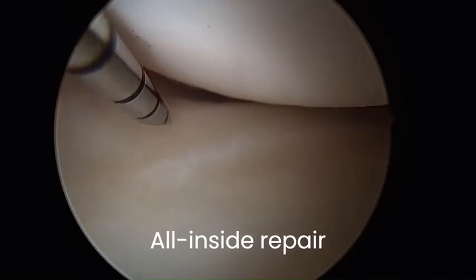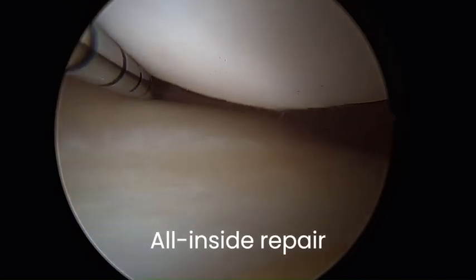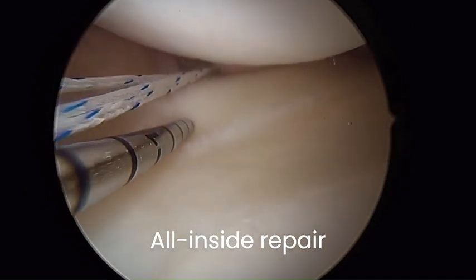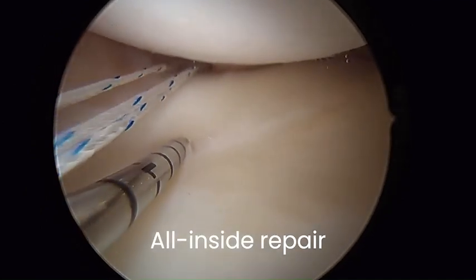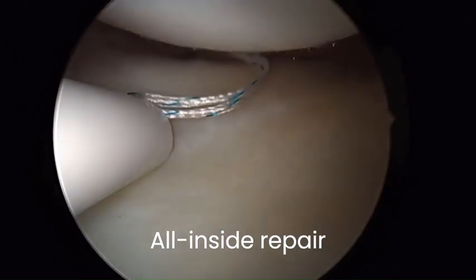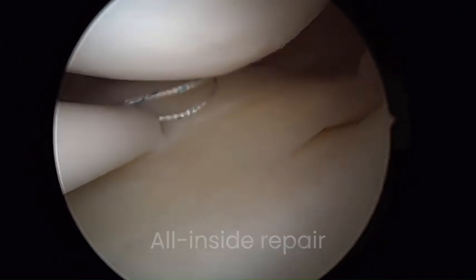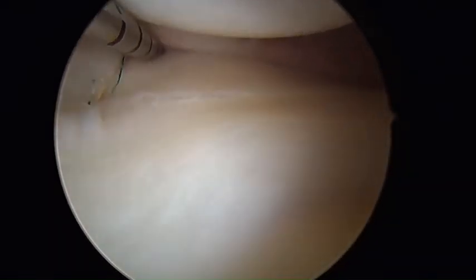First, we repair the meniscocapsular ligament in vertical suture configuration. The FosTFix 360 device from Smith & Nephew is introduced through anteromedial portal using a slotted cannula, with arthroscope in the anterolateral portal. The device penetrates the capsule to deploy the implant posterior to the capsule, and then penetrate the superior surface of the meniscus to close the posteromedial meniscocapsular gap.